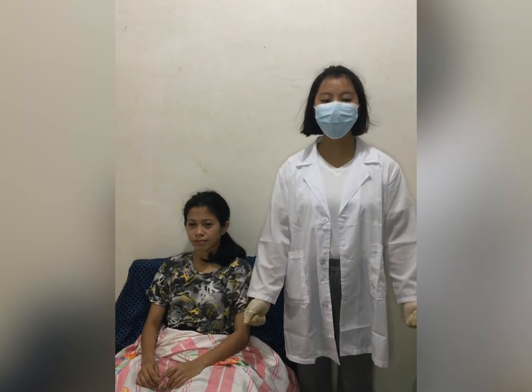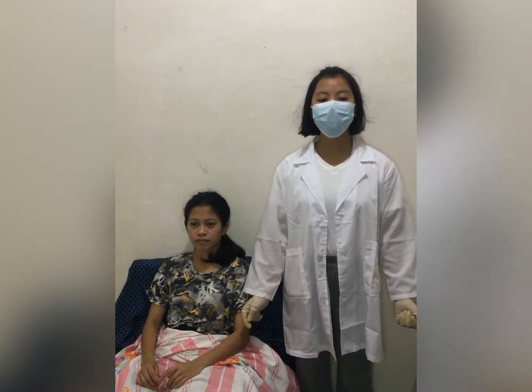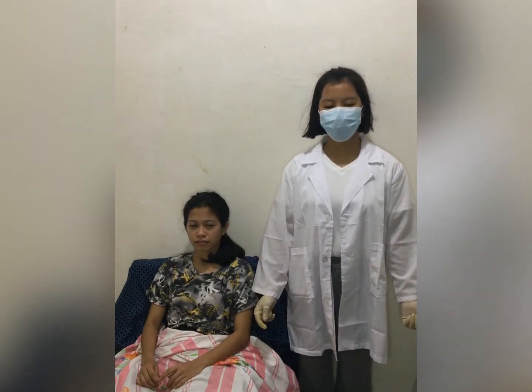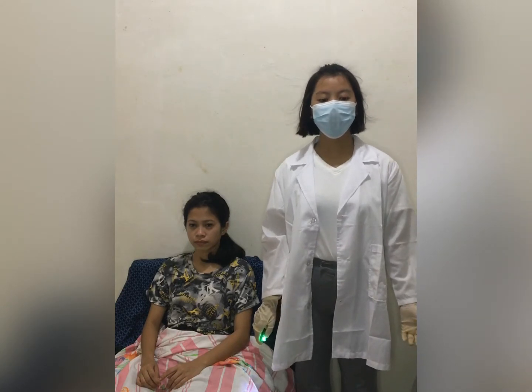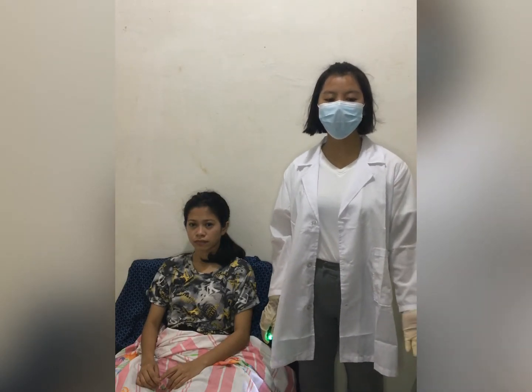Tip the client's head back. Facing the client, insert the tip of the closed speculum about 1 centimeter or up to the point at which the blade widens. Care must be taken to avoid pressure on the sensitive nasal septum. Stabilize the speculum with your index finger against the side of the nose. Use the other hand to position the head and then to hold the light.